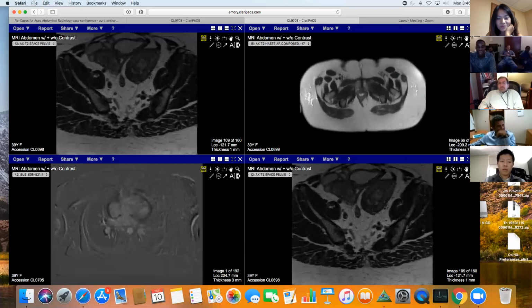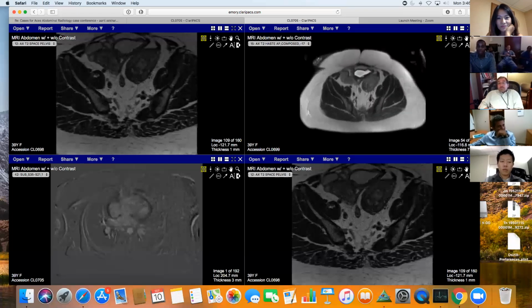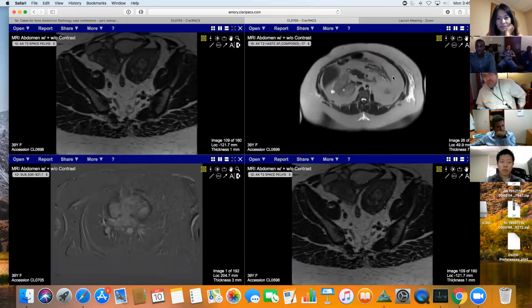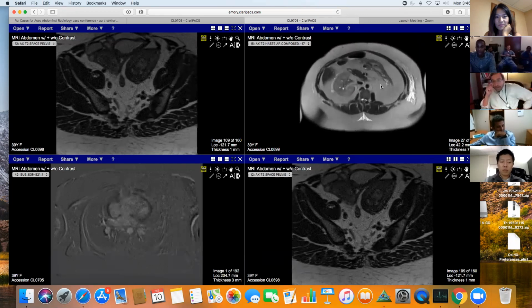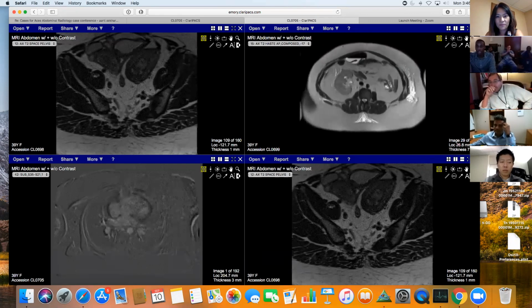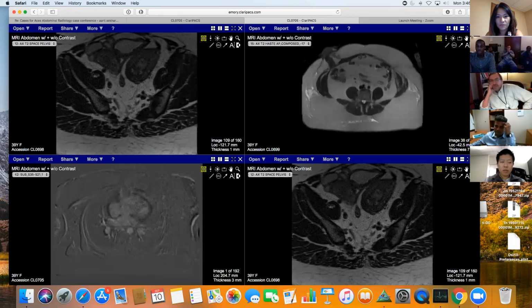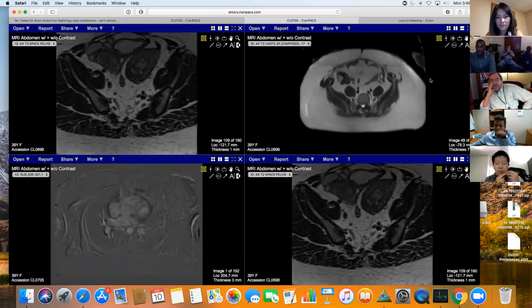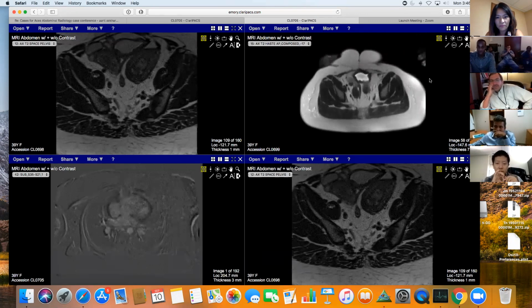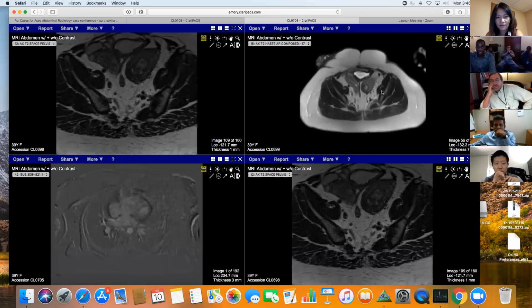Okay, so as you can see, her left kidney is absent congenitally. Obviously, she has a right lower quadrant colostomy. Does that mean she had anal atresia or something? Which kind of gets towards the syndrome that she has, which I won't mention just yet, I suppose.